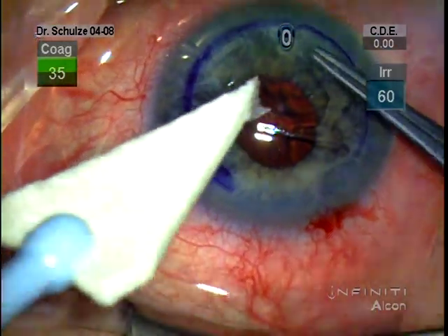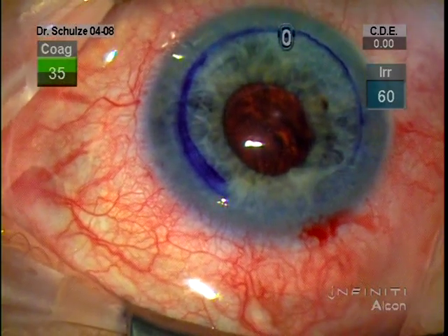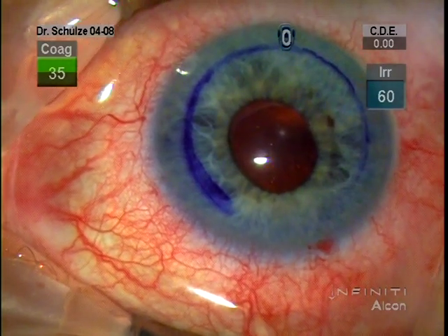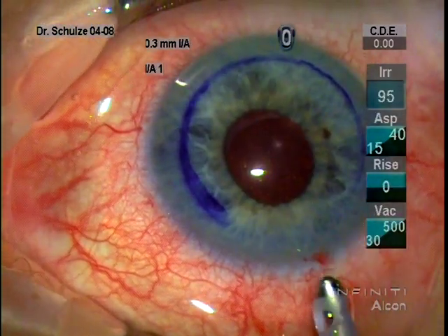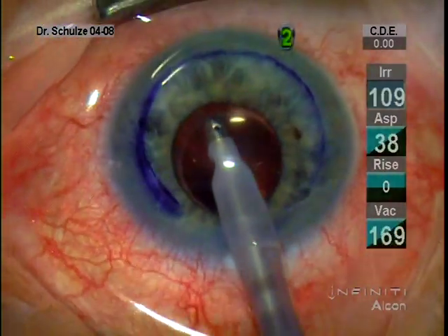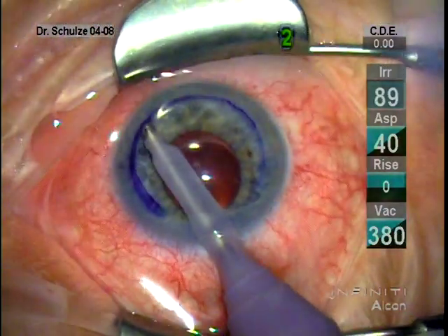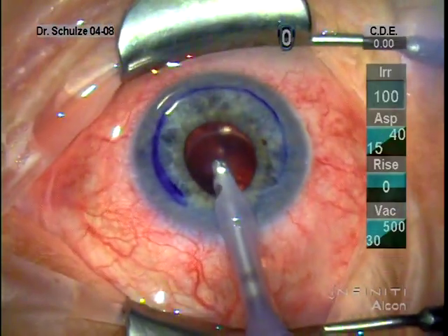One thing I'll mention that I did not do in this case, and some people recommend doing, is after Descemet's has been removed, you can use a scraper or an olive tip cannula to score the bed of the host cornea within the margin of your resected Descemet's. This is thought to improve adhesion of the donor. In this case I decided not to do that, nor did I use any venting incisions. I've found that venting incisions seem not to be necessary.